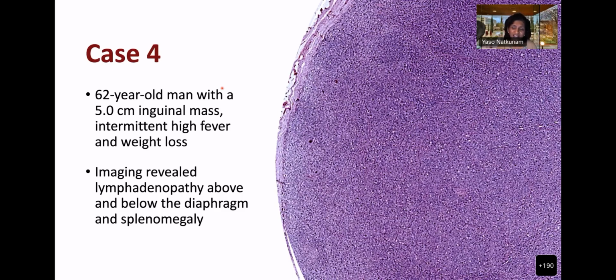Okay, and then can you see follicular lymphoma do this? That's right. Diffuse follicular lymphoma can do exactly that. So a pattern is not a diagnosis, and that's actually exactly what I'm trying to get at. And can you have a carcinoma or a sarcoma or any other non-hematologic thing do this?